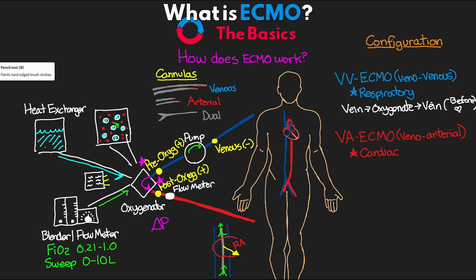This is going to be the type of cannulation like you'd see on a patient on bypass in the OR. And this is where they're going to have an open chest, and we're going to have cannulas right there in the vena cava as well as the aorta right there. This one, depending where you work, it may not be as common as just seeing like a fem-fem cannulation.